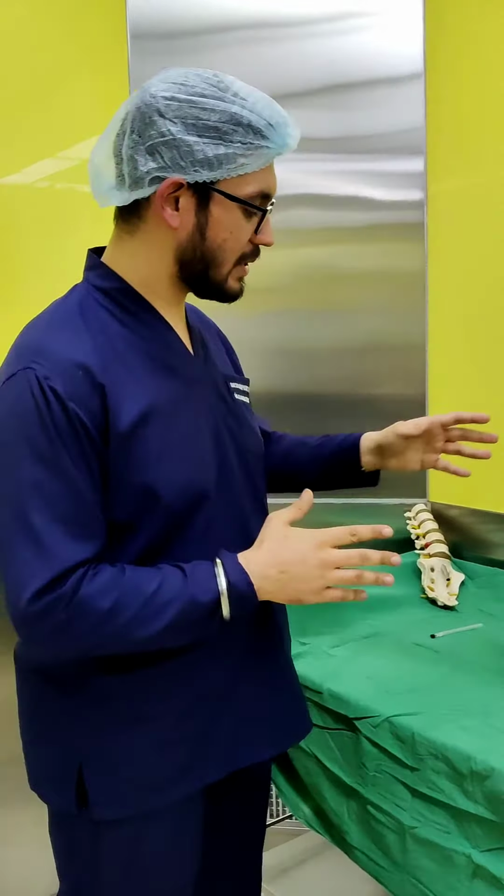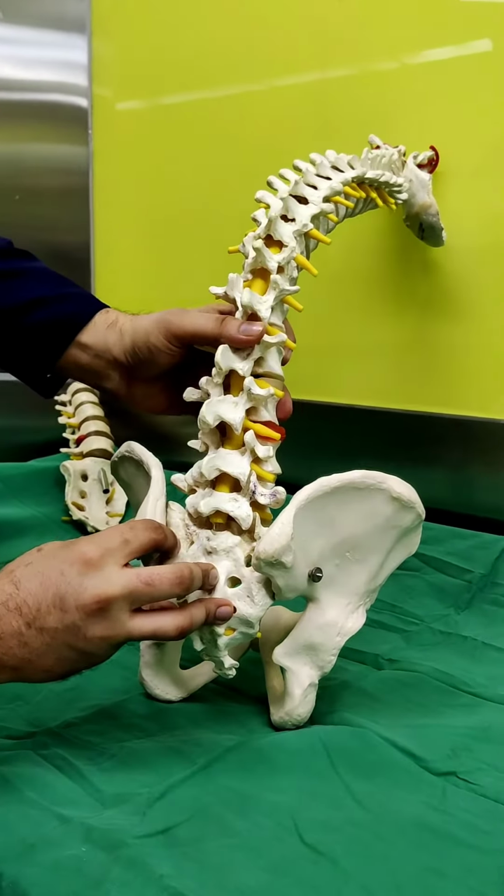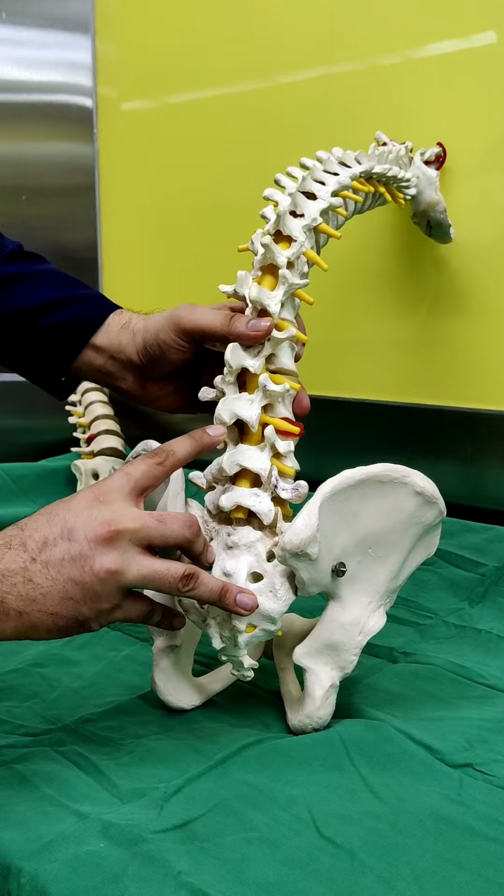So to perform spinal anesthesia, proper patient positioning is a must. So we give the patient a flexed back positioning. Flexing the back opens up the intervertebral spaces, so it also increases the target area.